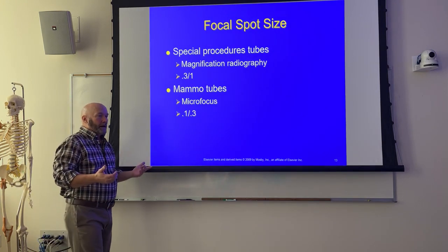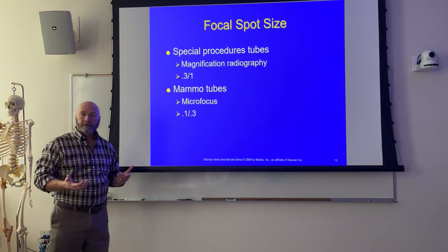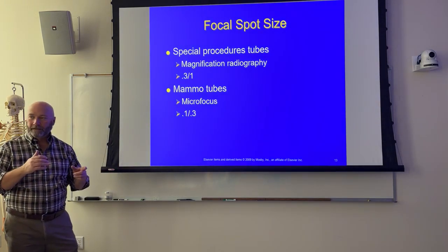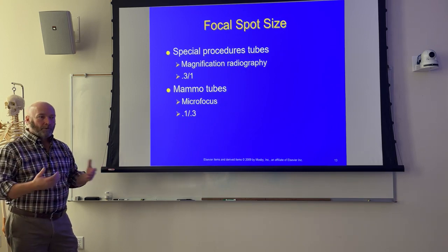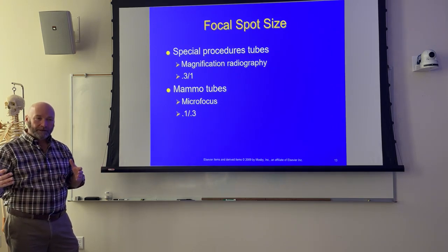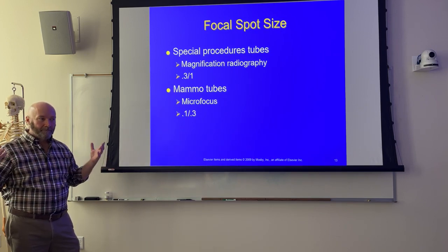And what we were trying to accomplish was, because we couldn't digitally magnify the image, we had to use an increase in OID to give us a magnified image.